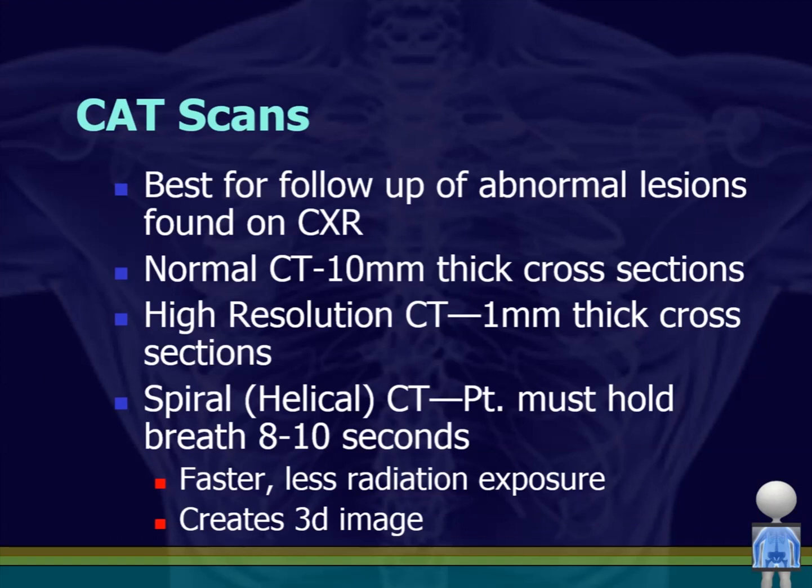That's how it works. CAT scans, there's a lot of reasons why you use CAT scan. We can't cover that all in this lecture. It will be covered as you go through clinical medicine in each specific area, as will the nuances of tuberculosis and sarcoid and what have you that we didn't cover today, because we're just talking about chest X-ray and a little bit about CT. So yes, definitely for a follow-up, CAT scan is almost never your first scout look at what's going on. It's seldom that you should use this as a scout look. You should have an idea of what you're looking for before you order a CAT scan one way or another.